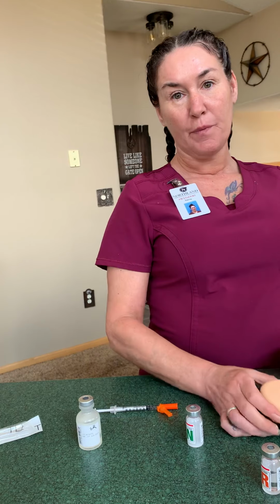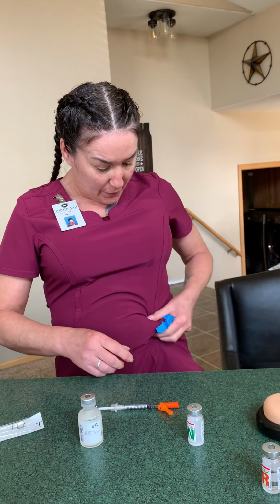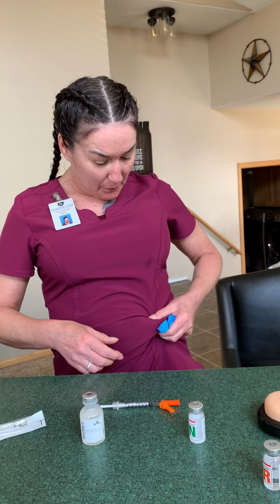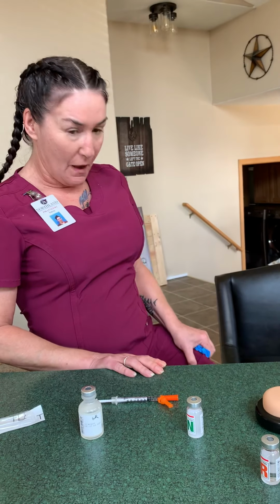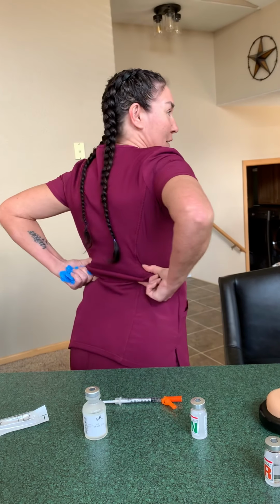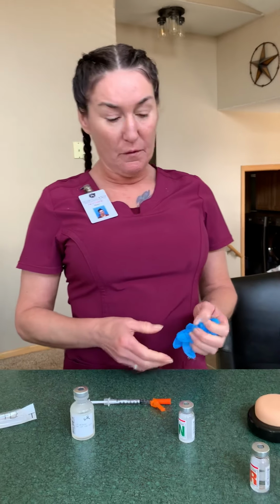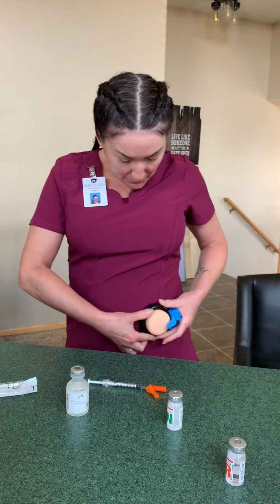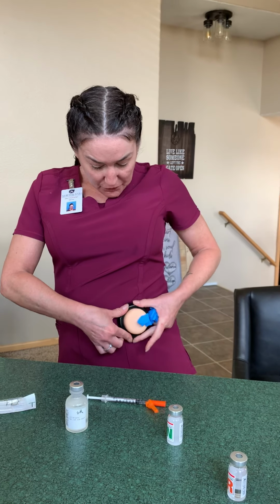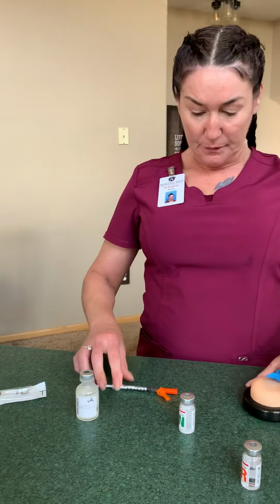For our purposes again today, we'll be using an injection pad. For an insulin shot, you want to give into the fatty area about 1 inch from the belly button, the back of the arms, the front of the thighs, the back fat here. Any of those places would be acceptable for today. Again, we'll be using the injection pad. We'll pretend that it's on our patient. Basically anywhere where you can pinch 1 inch.